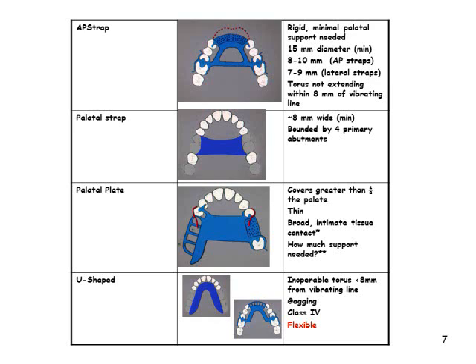Complete palatal coverage is occasionally required. In most situations, such as in the Kennedy Class II arch, with a posterior modification space, and some missing anterior teeth on the distal extension side. A Class I arch with 1 to 4 premolars and 1 to 6 anterior teeth remaining, where abutment support is poor and cannot otherwise be enhanced. Also, where residual ridges have undergone extreme vertical resorption and where direct retention is difficult to obtain.